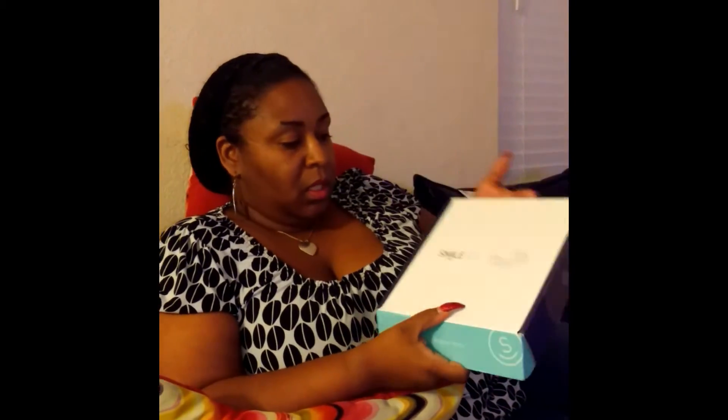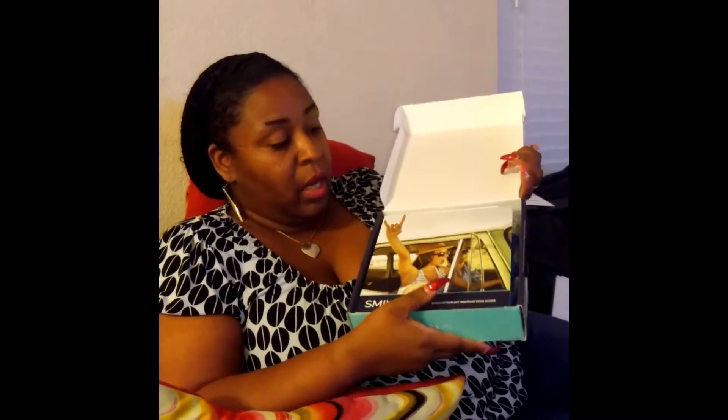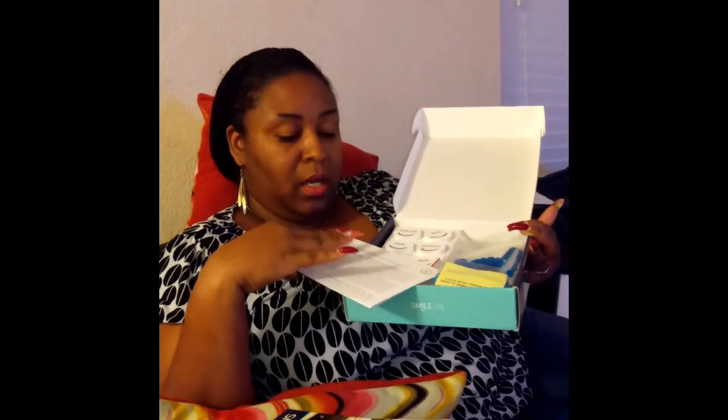So the kit comes like this — it came in a box. You guys are seeing me open this together. So it comes with a booklet that has all the instructions, the contents, your history. They send you dental history paperwork. What you do is you fill this stuff out — they want to know the background of your dental history. You fill this little thing out and send it back along with your mold.